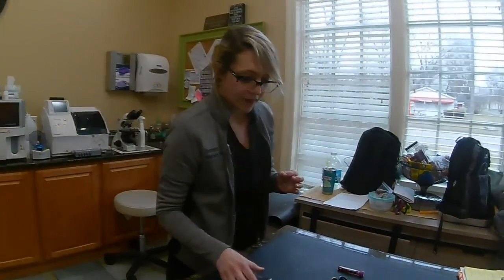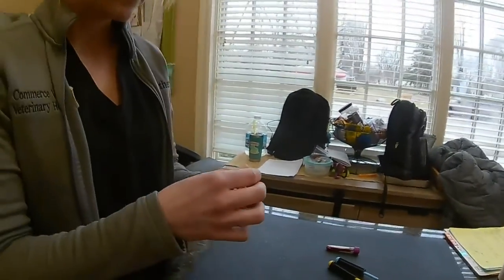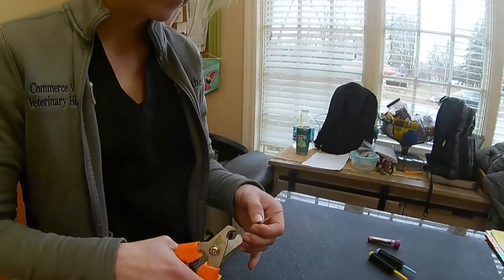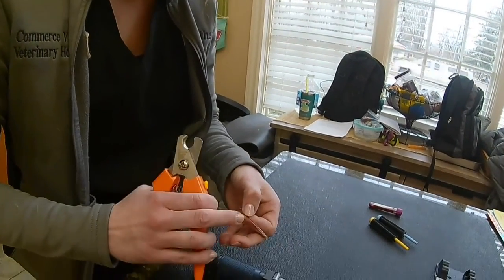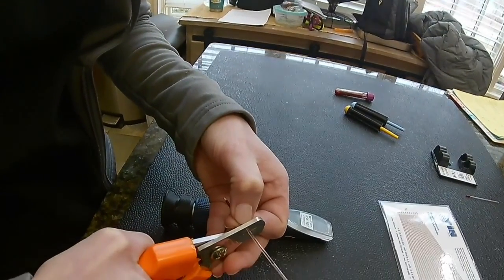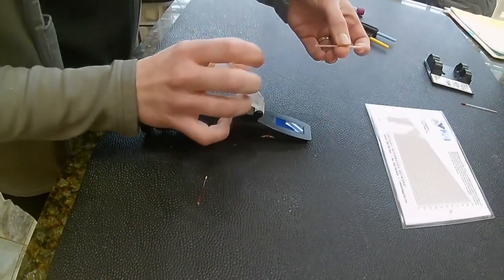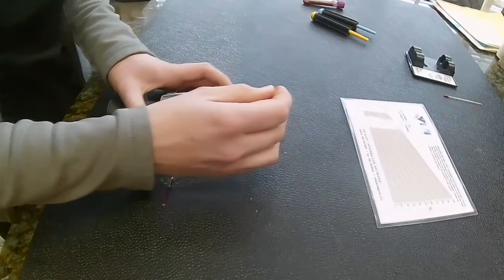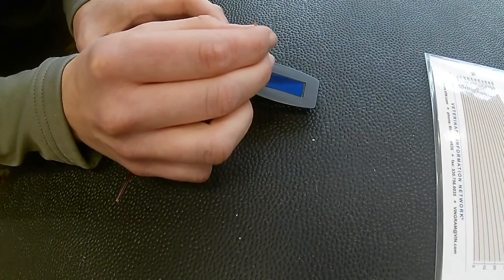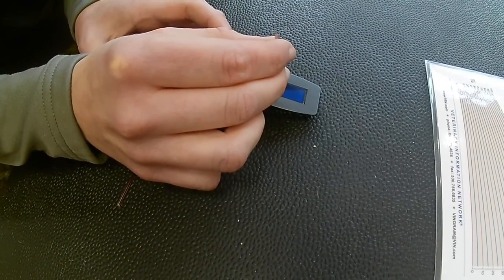So what I'm going to need for that is my refractometer. I do need to break this just above that buffy coat. I'm going to use some nail trimmers to help me kind of make a hopefully clean cut. So right here I'm noting the buffy coat, and I'm going to cut right above that. Okay, and this is what I'm going to put onto that prism. Very gently. If I can get more out, the better.